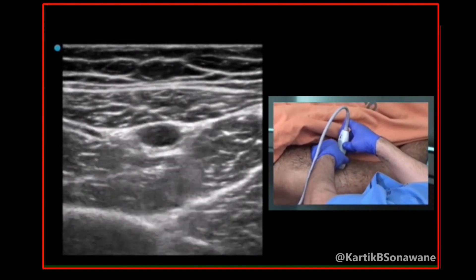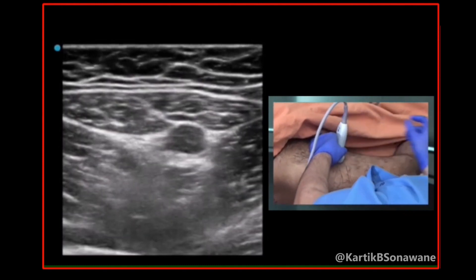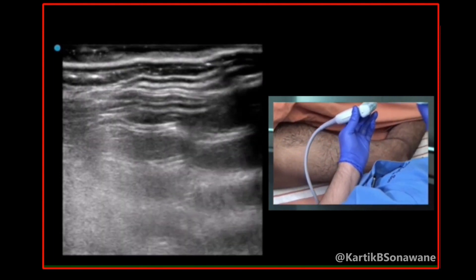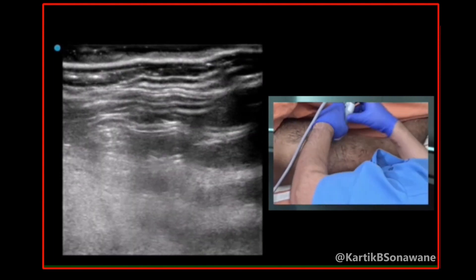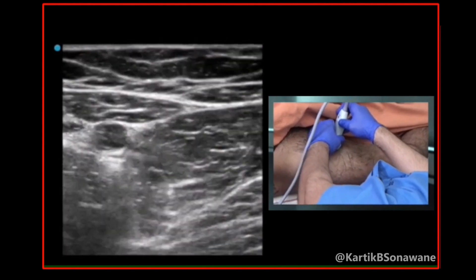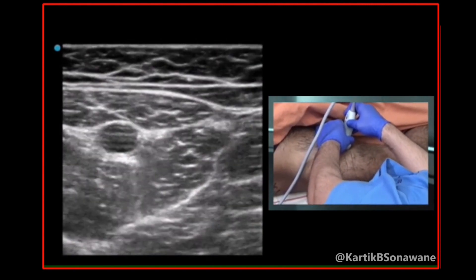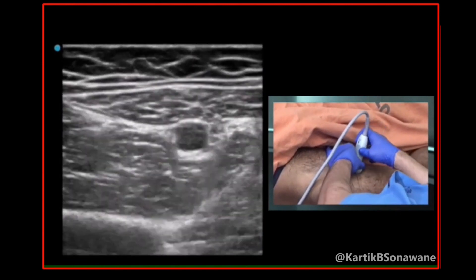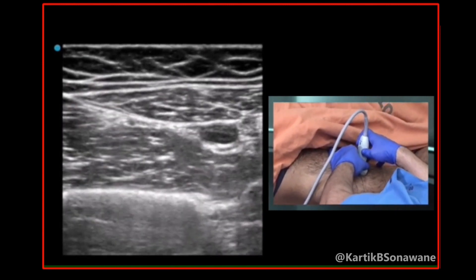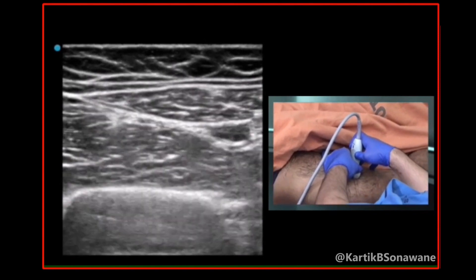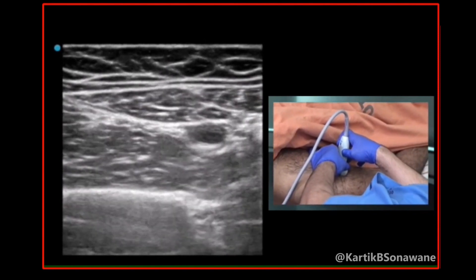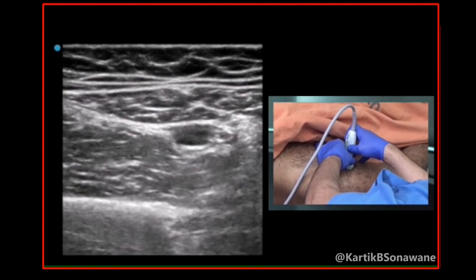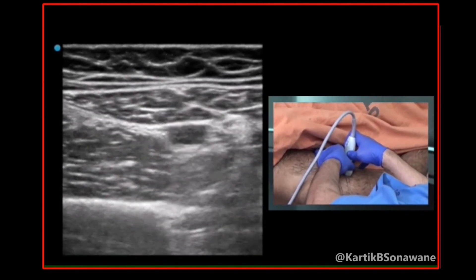The high PACK block involves injecting a high volume into the proximal adductor canal area. Again, identify the apex of the femoral triangle, move one to two centimeters distal to enter the proximal adductor canal area, then inject around 30 to 40 ml of drug — first targeting the saphenous nerve, and then depositing the remaining drug below the vasoadductor membrane next to the femoral artery.